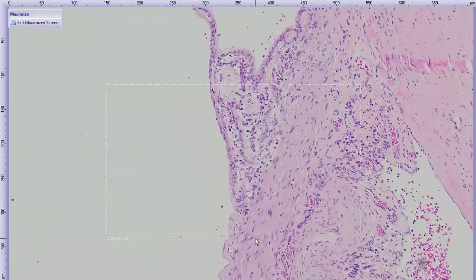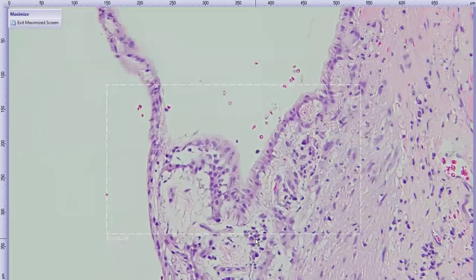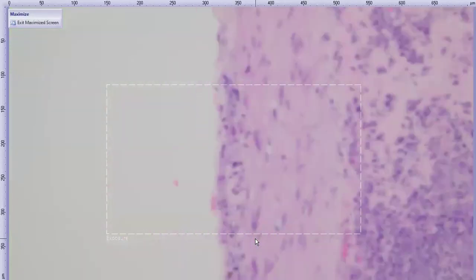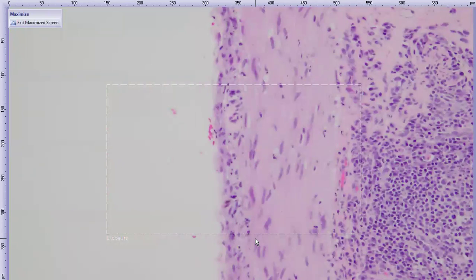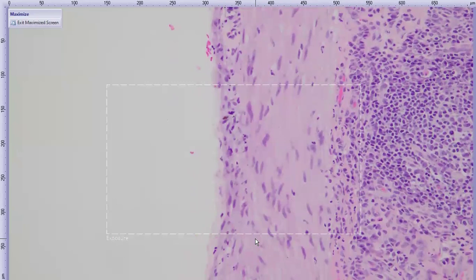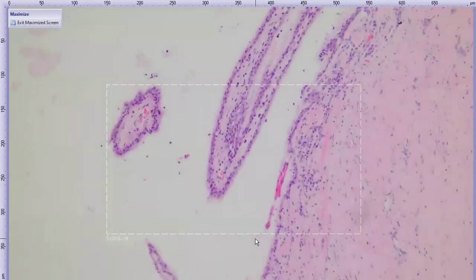And the inflammation is relatively milder than our classic case, but one of the most striking features of this case is that if we look on the back of the iris and in the ciliary body, sometimes the pigmented epithelium at the posterior iris is basically just absent. But in other areas, it's still there. You can make out this layer of cuboidal cells, but there's no pigment in any of these cells. And even in a blue-eyed patient, we should have pigment in that posterior pigmented iris epithelium.